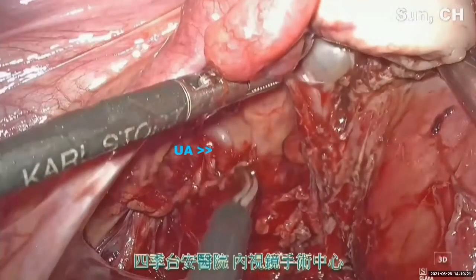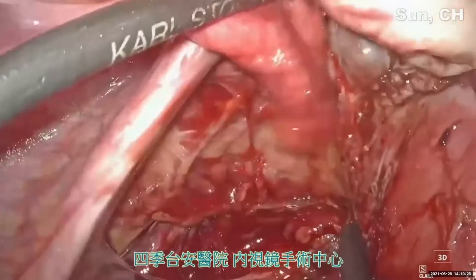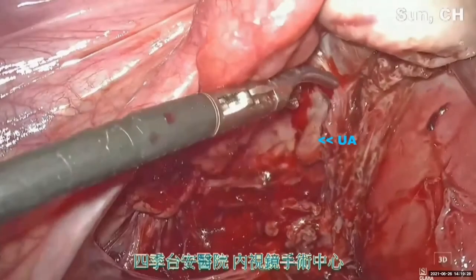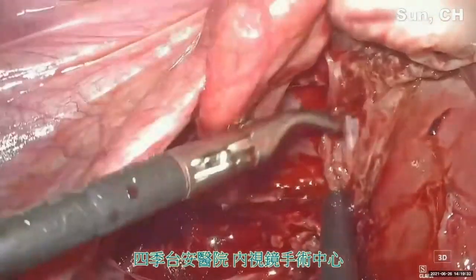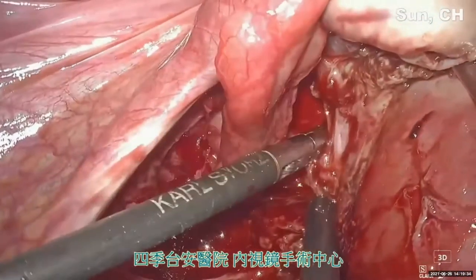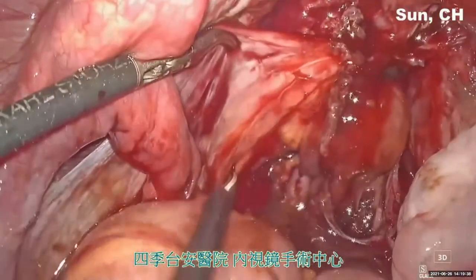Now we can see the uterine artery here, and also here near the uterus. And here we may have a communicating branch between the ovarian vessels and uterine vessels. We have to be very careful.